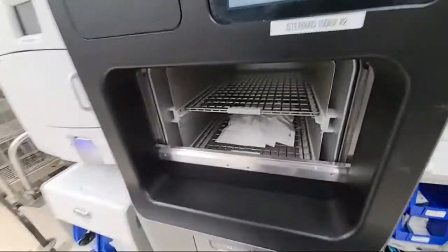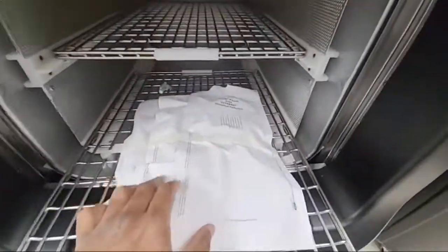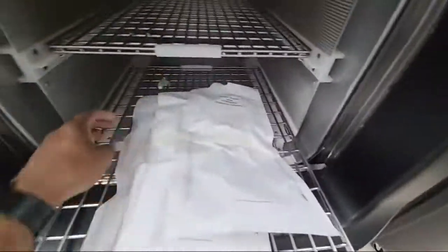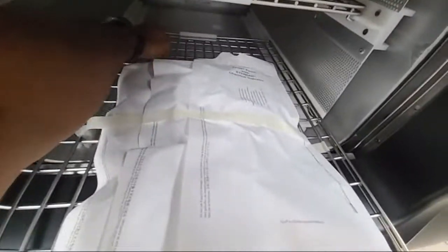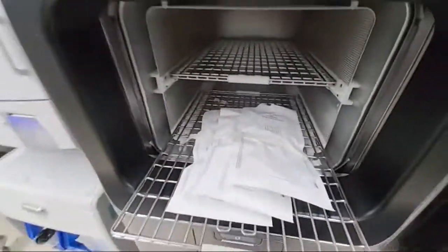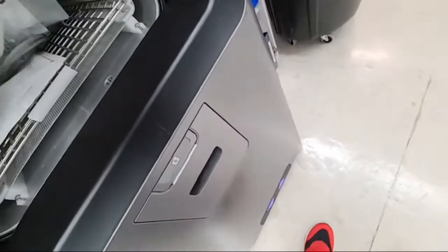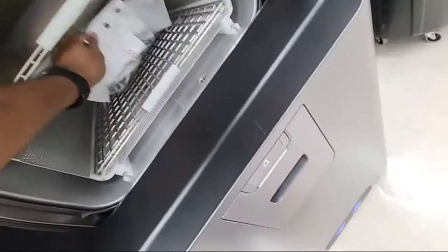This is our newer one, our fancier one. So in here we have some peel packs we just did. We taped the whole darn thing down. What is this? Here's the BI, the biological indicator. Also taped down like it's going through a plane crash. Alright. We gotta find out what those are to mark it later. The cords. I think they are cath lab cables.